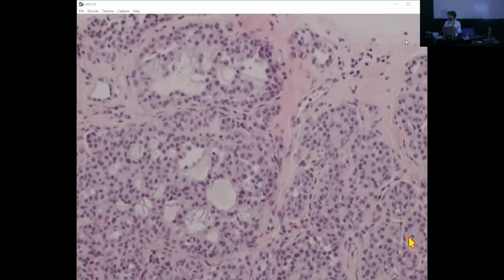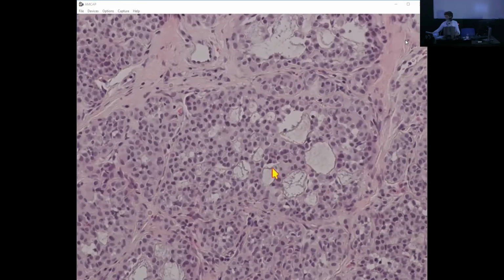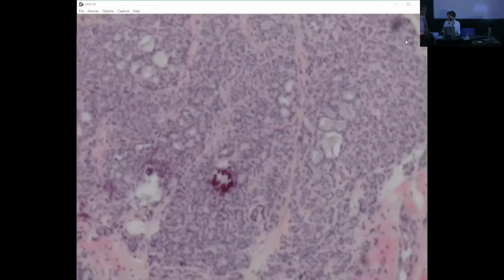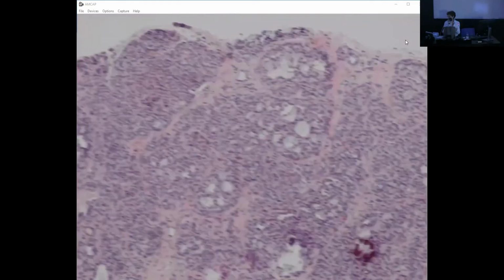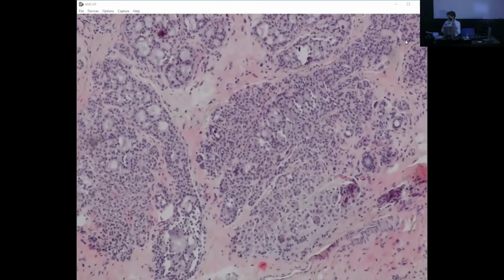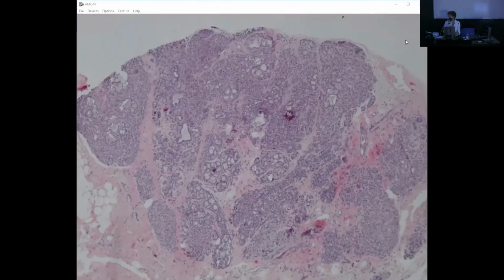So I'm glad, it's quite characteristic. There is the cord sign right across here and here and here. The basement membrane has kind of collapsed. These spaces are not true cribriform spaces. They're filled with material, this delicate material. It's a nice case that was actually mass forming, probably also because it looks like there is a discrete nodule in this area.